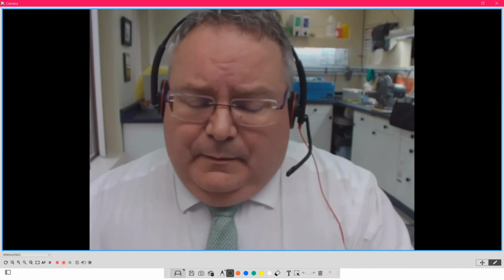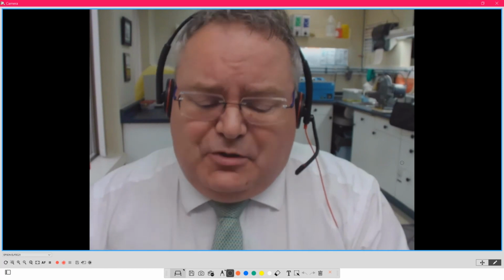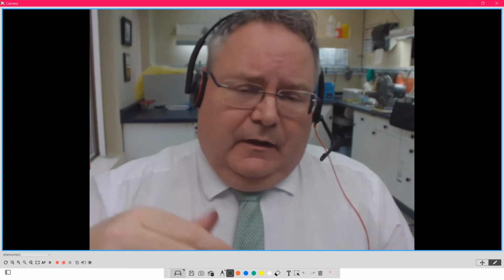So the benefit on the class 2 was being able to show you that I have all of these different things and different options available to me to be able to make that work for the case sitting in front of me without taking a great deal of time, because they'll just kind of tip in and tuck into each other the way that they're designed. So we have the easy find centric.